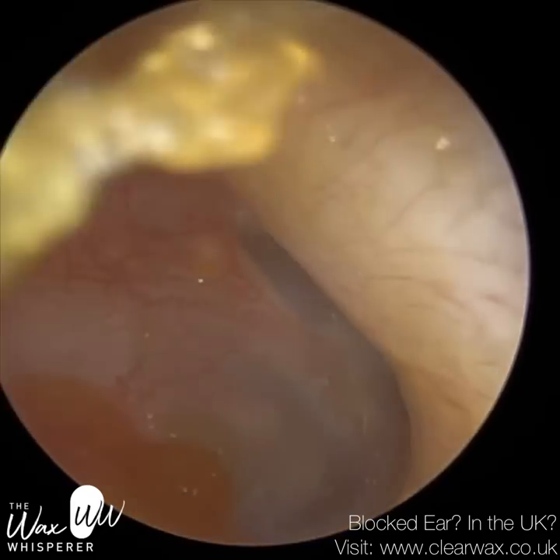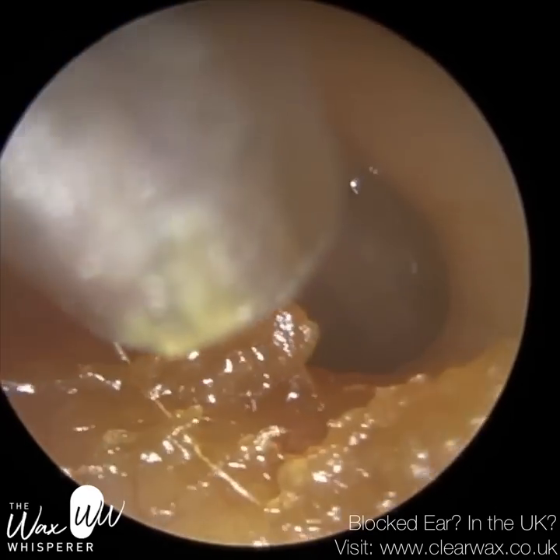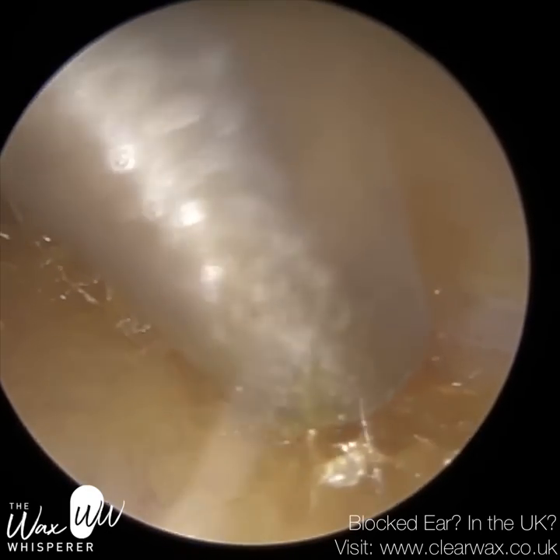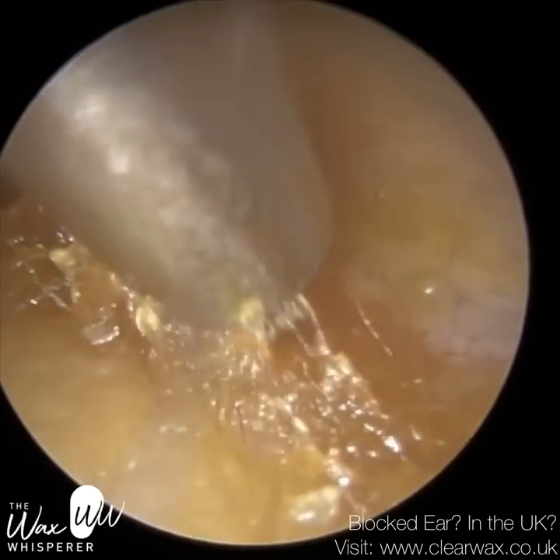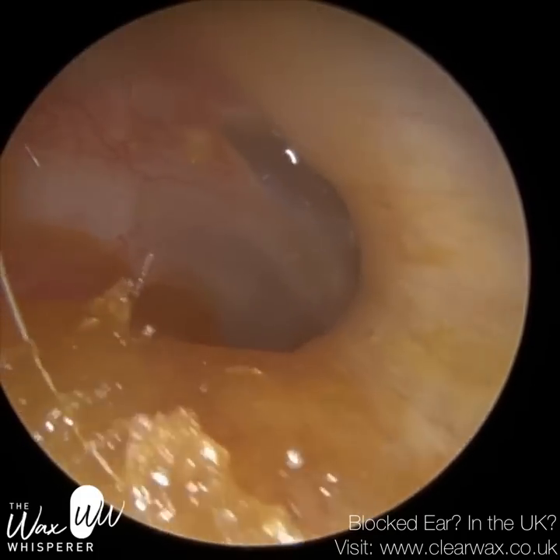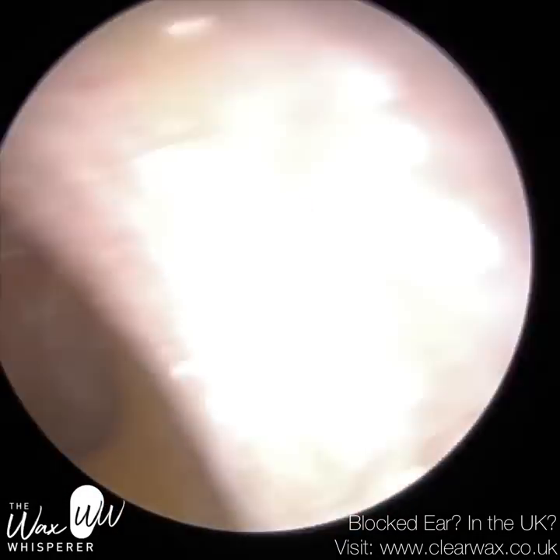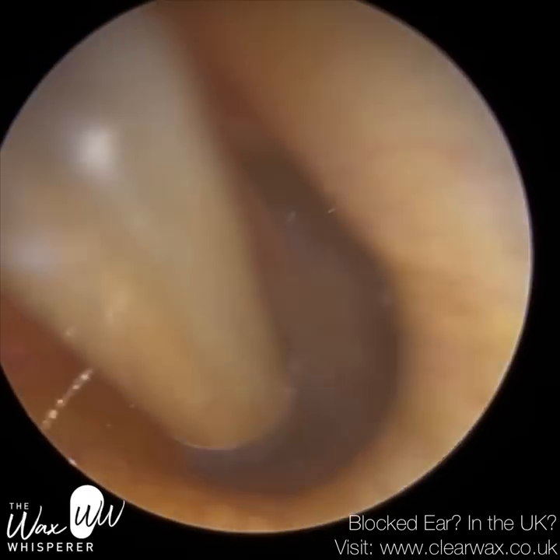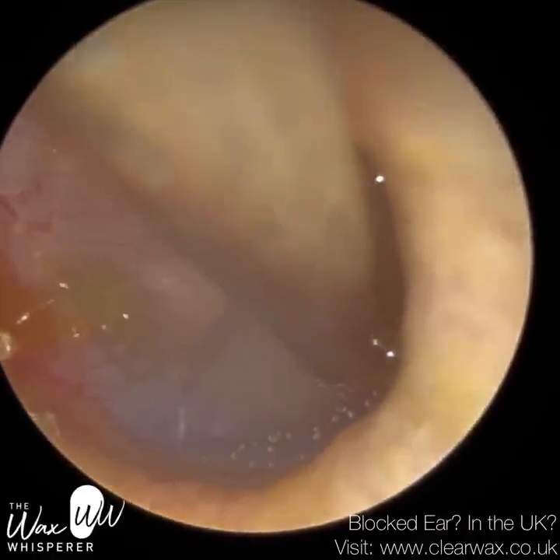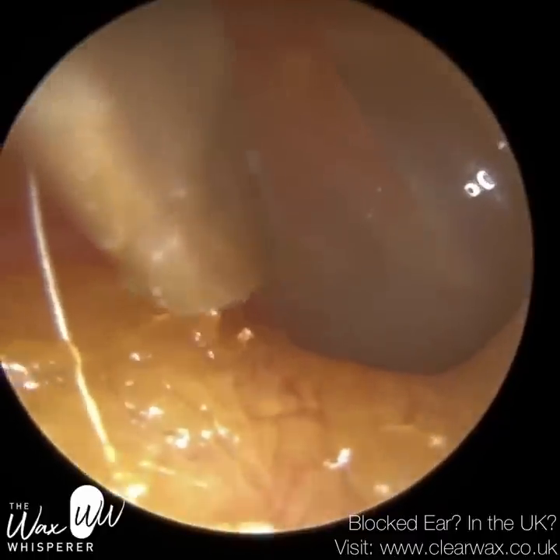The acetic acid — the white vinegar — is included because getting water in your ear can wash away the natural layer of wax. You can actually see this on this patient right now: I've got the blockage out and you'll see a very thin lacquer of wax, which is good. That wax moisturises the skin, is acidic to help prevent bacterial and fungal growth, and acts as an insect repellent. I'm just suctioning some wax here and also some olive oil that got trapped in the inferior anterior recess — I had put some olive oil in there.